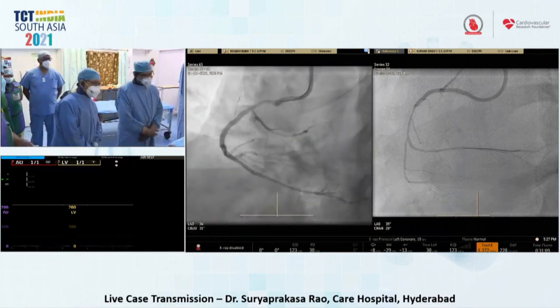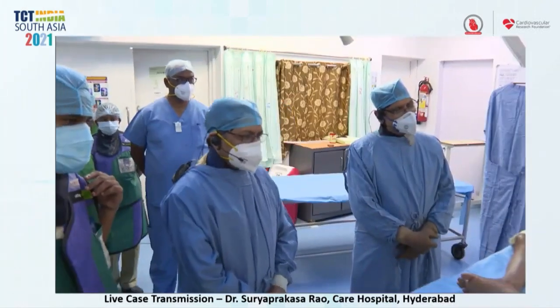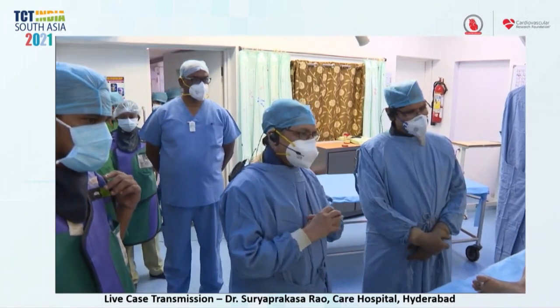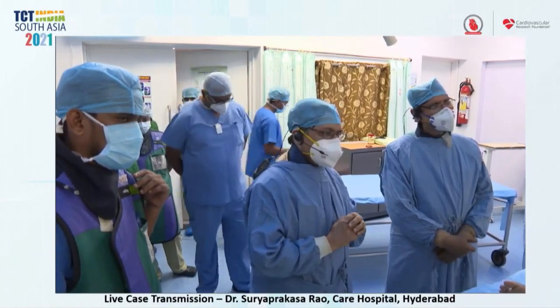Thank you, sir. Excellent demonstration. Normally we thought we would take a long time for CTOs, but luckily the soft wire crossed and the job was easy. Thanks for showing a good case, and thank you for joining for TCT.